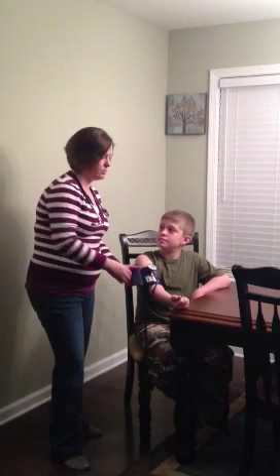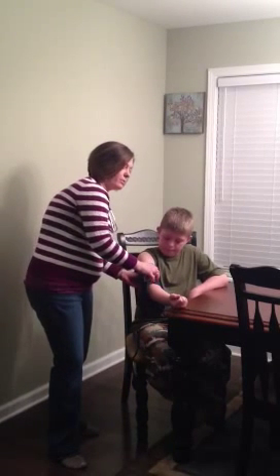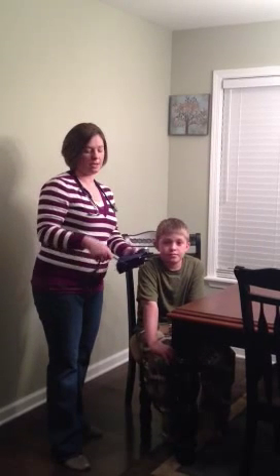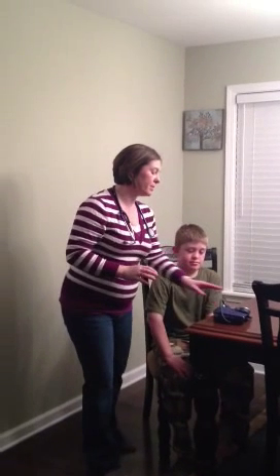Okay, and his blood pressure was 88/60, which is good. So now I've let out all the air in the cuff, and I'm going to take it off. And that's good for him, but also, as with the lungs, you can compare both arms, because both arms won't read the same thing usually. So you listen to both arms and pump it up.